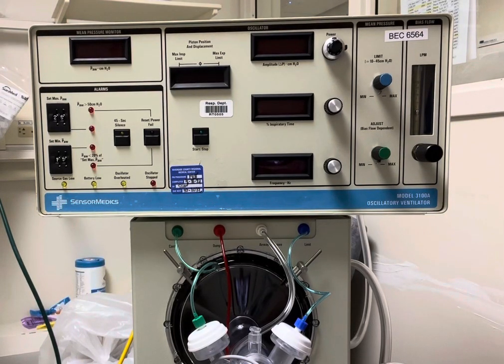In this video we're going to review how to set up the oscillator. This oscillator is a 3100A, specifically for the neonatal population.